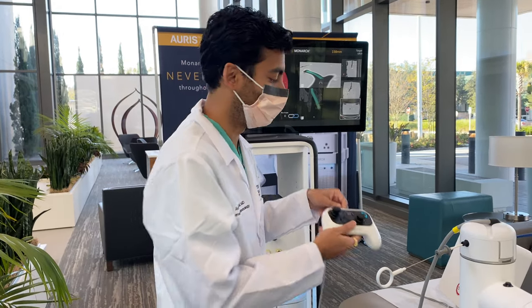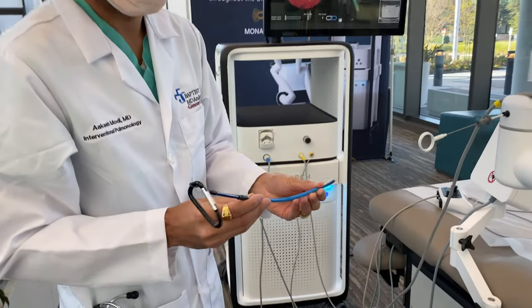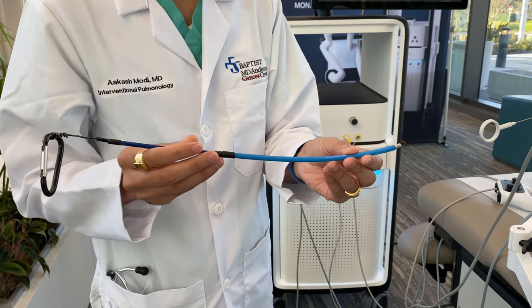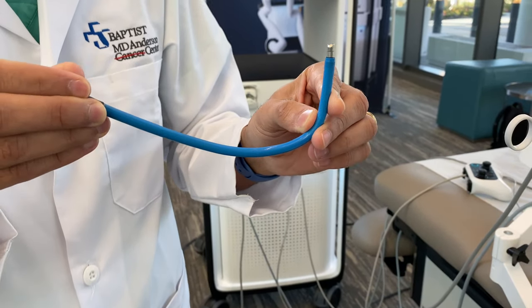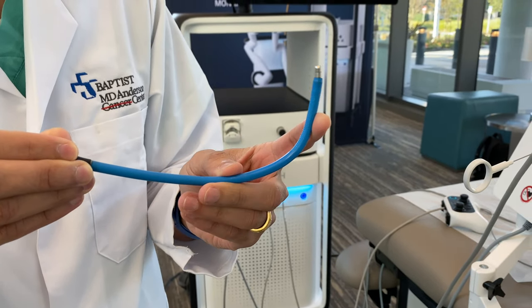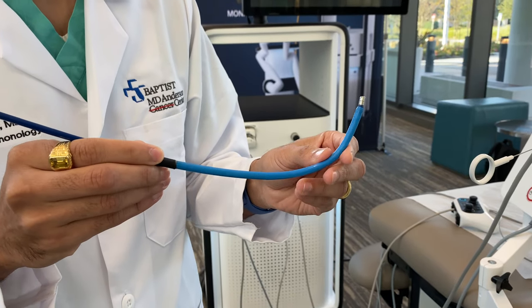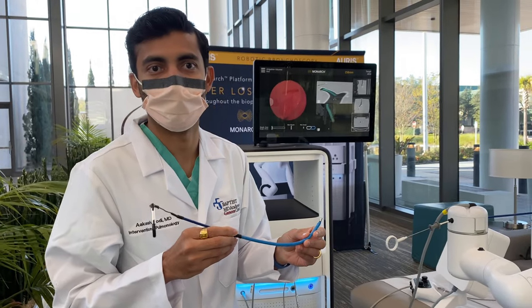This is extremely important to appreciate. The phenomenal aspect of the technology is actually the scope and the sheath, as demonstrated here. The phenomenal ability for it to articulate up to 180 degrees is its strength, which our prior technology platforms do not allow, as whenever you pass biopsy tools with the current bronchoscopy technology, they tend to move within millimeters, and that could mean a non-diagnostic yield.